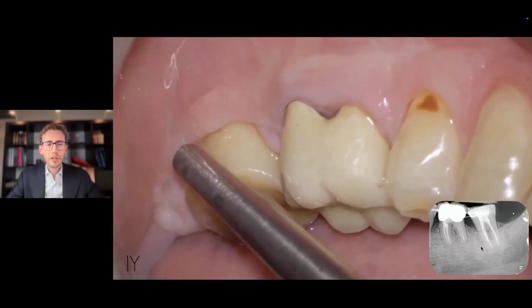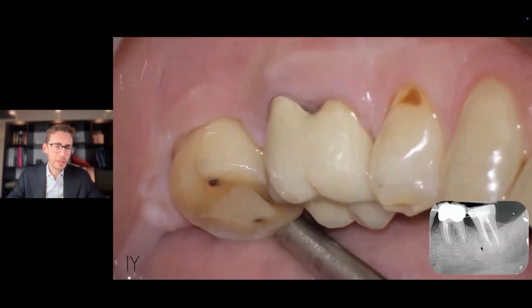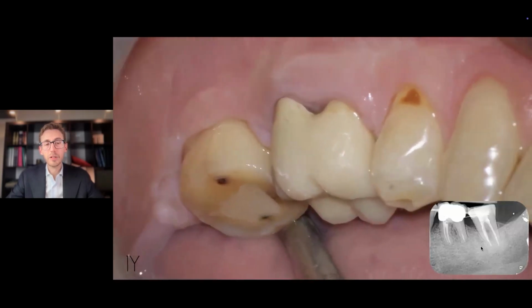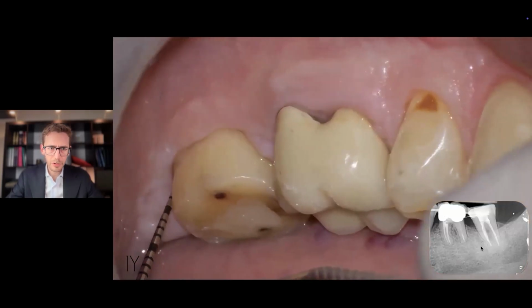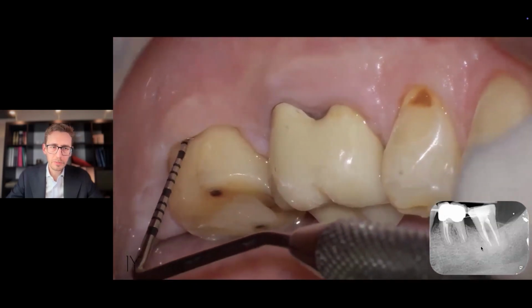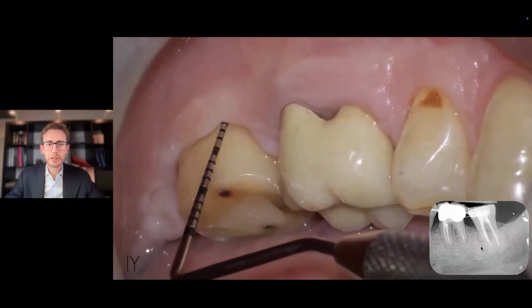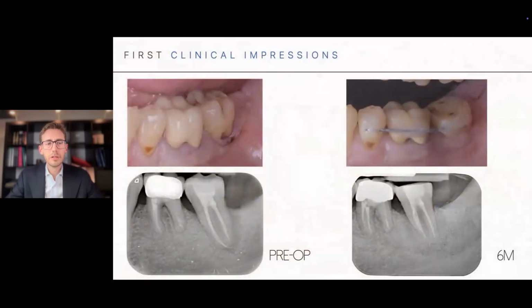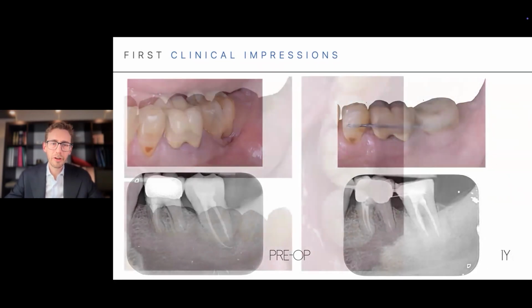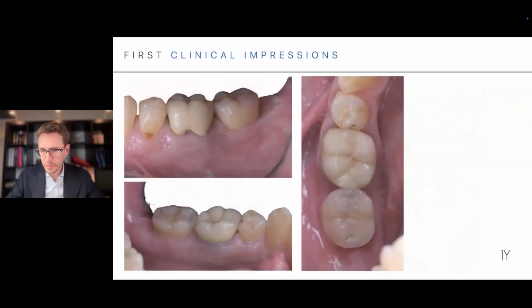You see, once again, after the removal of the splint, that when we perform probing around our tooth, there are no residual pockets and there is no residual bleeding on probing. So the patient is finally ready to receive a simple ceramic overlay on top of the occlusal reduction that we had performed at the end of the surgery in order to establish a functional occlusal surface.